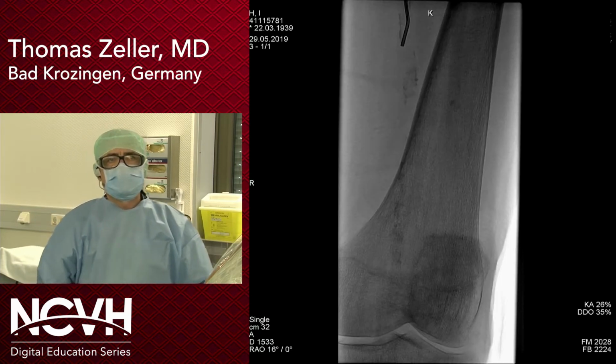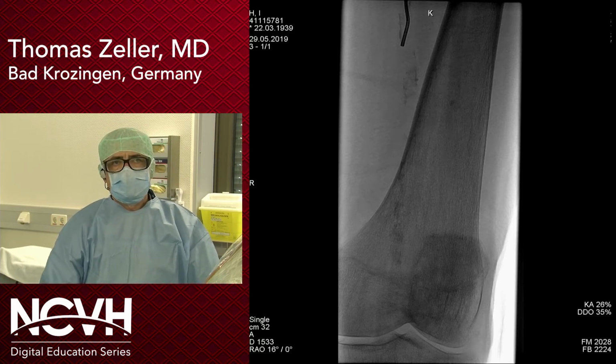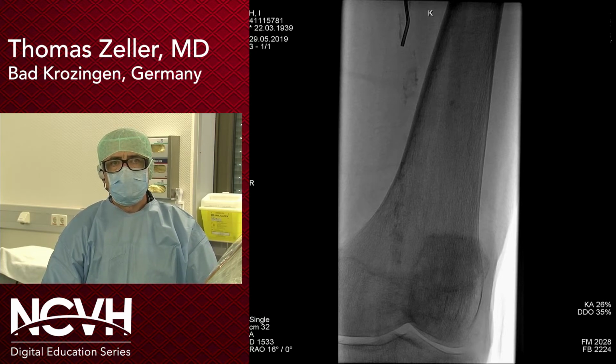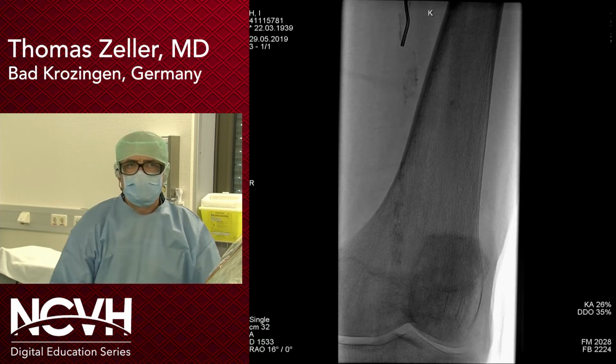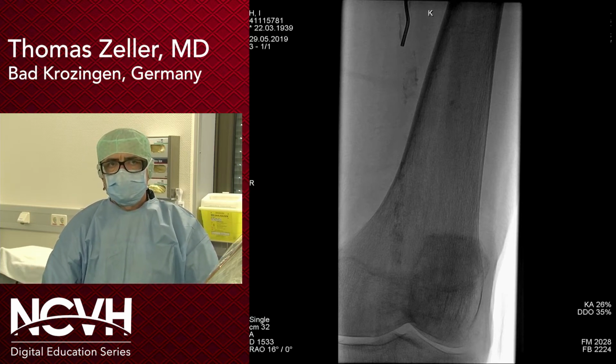And this is now my recanalization attempt. Dr. Zeller? Quick question. What was the time frame between the angiography at the outside institution and today? Because it looks like that island of reconstitution in the popliteal has disappeared. No, it's still present. I will show you. It seems to be a little bit shorter than it was initially. So the angiogram was performed about 4 weeks ago. So it's about 1 month's time difference.